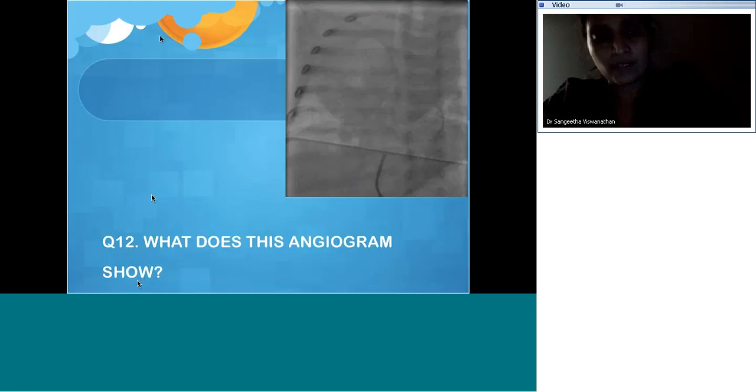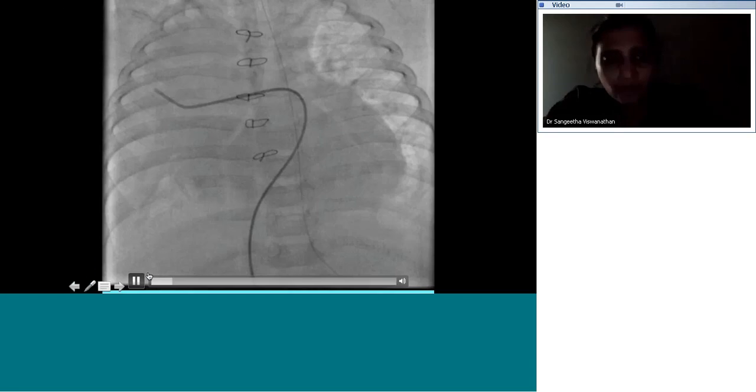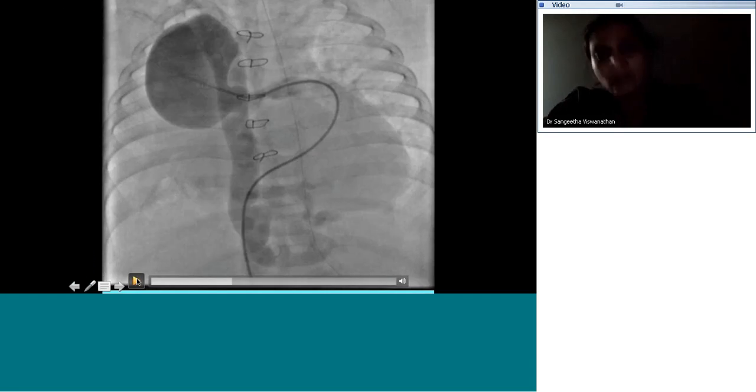Oh, sorry, hold on, sorry. I'm trying to freeze it at a frame that's a little, okay, that's it.